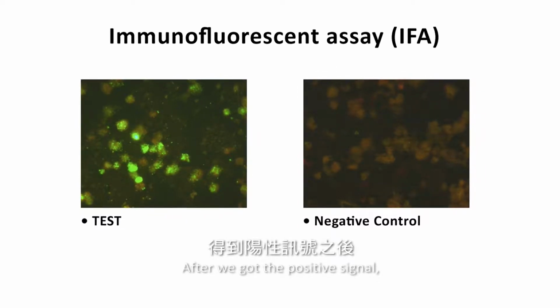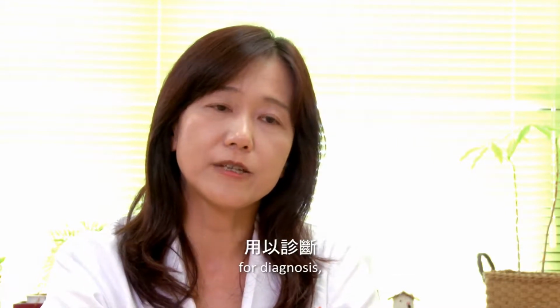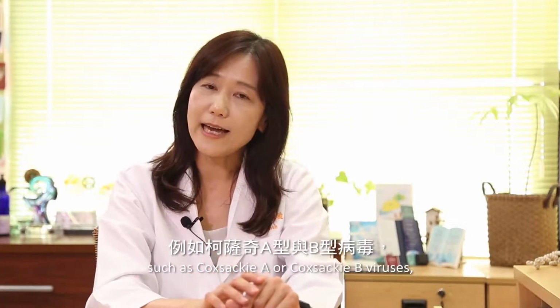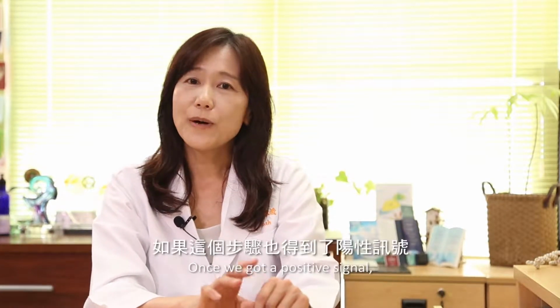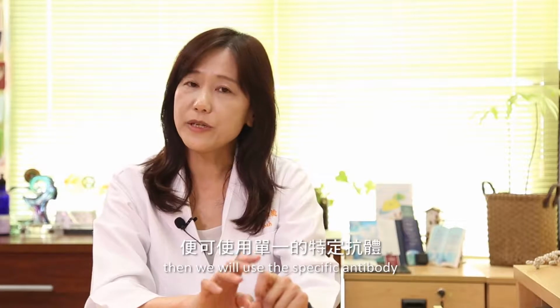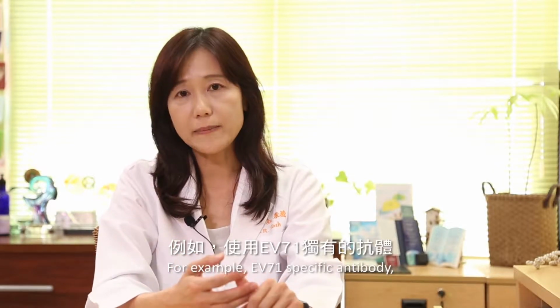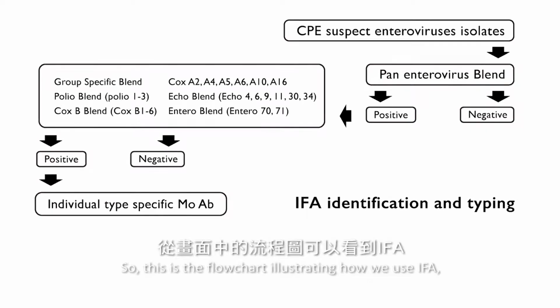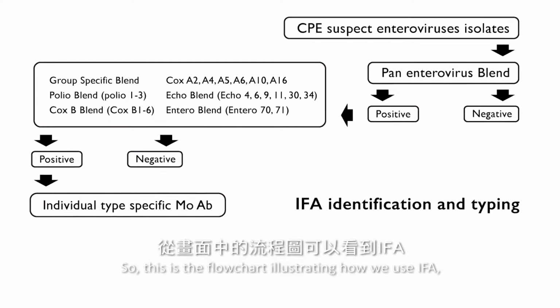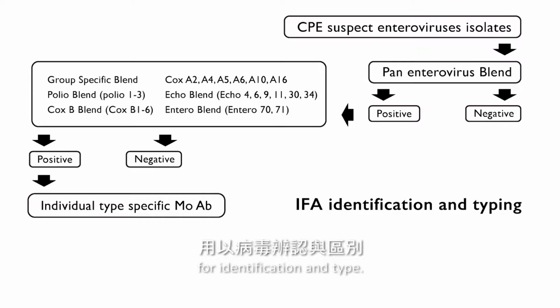After we get the positive signal, we will use the group-specific blend antibody for diagnosis, such as Coxsackie A or Coxsackie B or ECHO or numbered enteroviruses. Once we get a positive signal, then we will use the specific antibody for final confirmation. For example, EV71 specific antibody to know the patient got infected by EV71. So this is the flow chart of how we use IFA, immunofluorescence assay, for identification and typing.